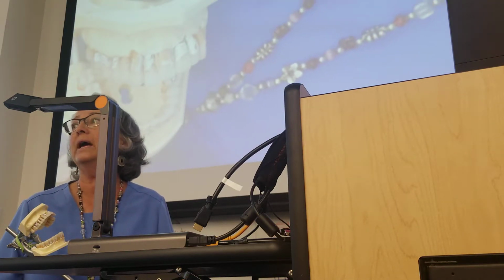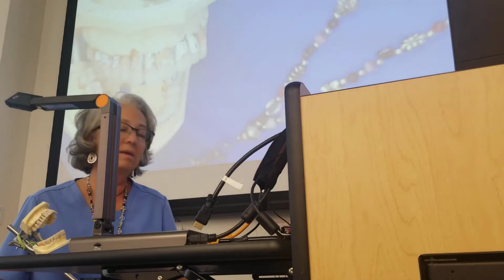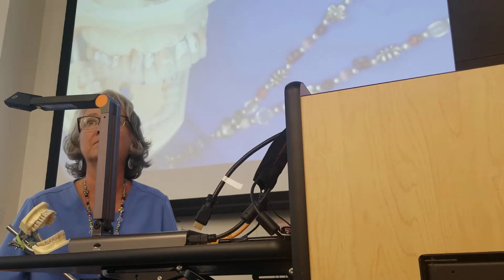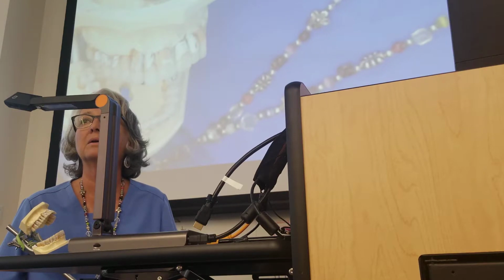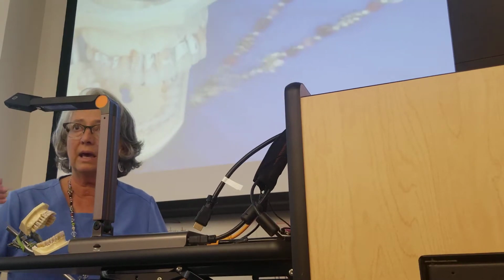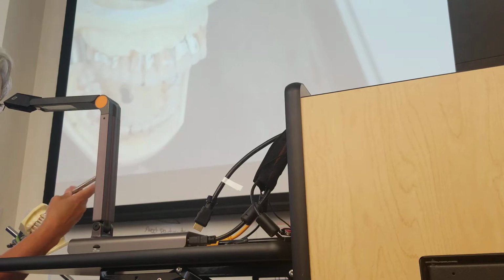Only the outer edge is used to instrument the anterior teeth. Does the working end change when you're doing towards you and away from you, for the anteriors? So, same working end.